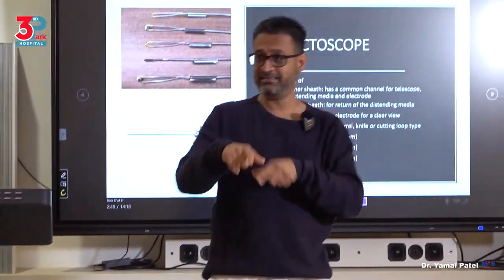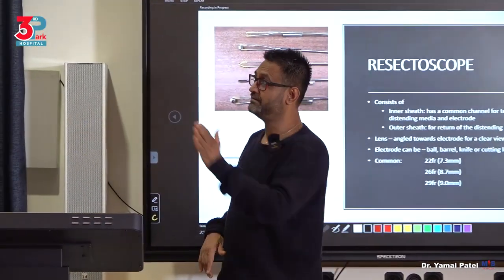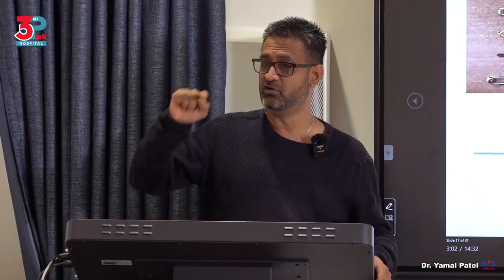You can put in the scope and see, but when you try to resect, you'll realize, okay, I'm struggling here. Why am I struggling? Because you're using a 30-degree scope on a resectoscope. You've understood? Where your electrode is rigid, you can't turn it and you're viewing something different. So that's where you'll get stuck.